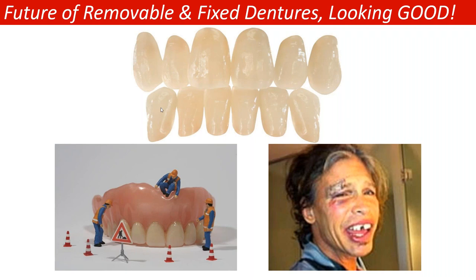We have another question. Back to crazing, fracturing. I sit here at the help desk, my colleague and myself, and for years now, I have had calls about various competitive denture teeth, and the reason why they moved to VITA was because they don't fracture. Again, fracturing of denture teeth is caused by the wrong setup, the wrong occlusal adjustment. Someone within the process, we have to go back and say, why is this individual tooth fracturing? And it fractures for a reason.